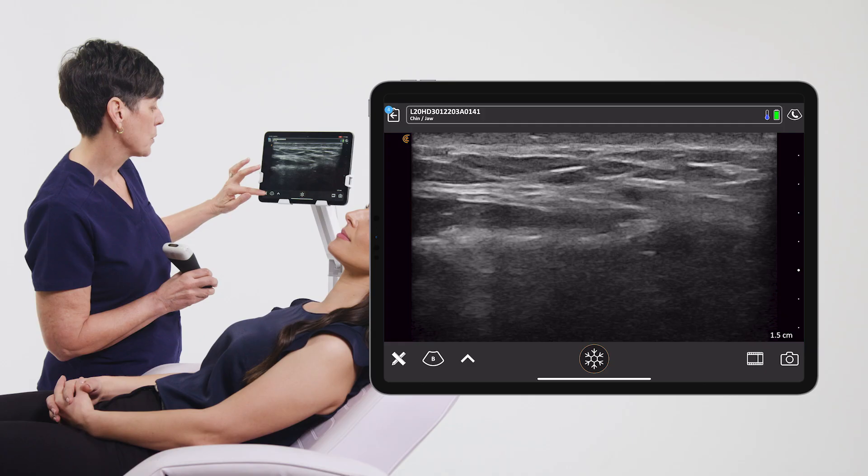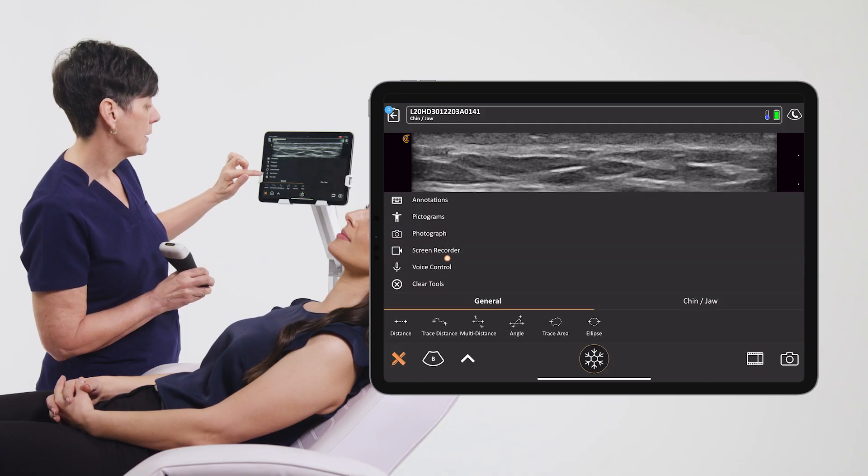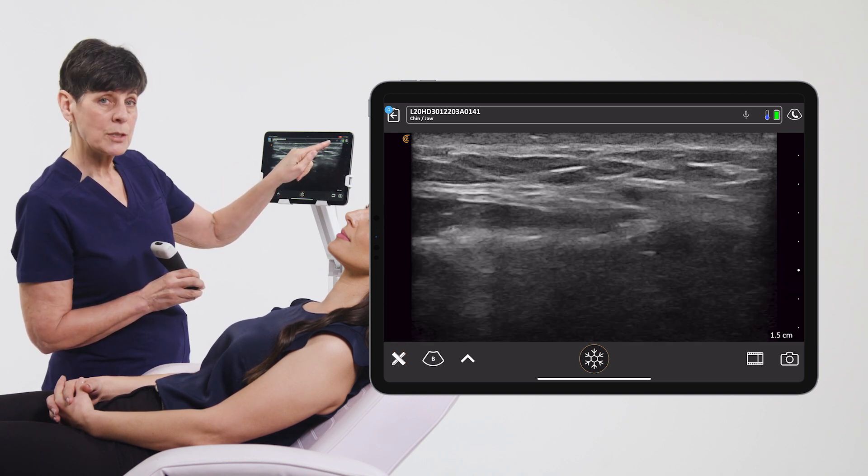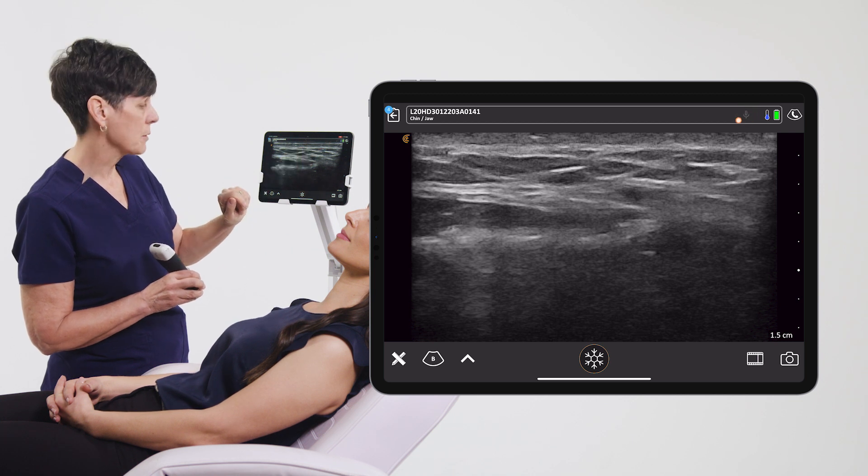So let's see how it works. We'll just go into the tools menu and tap on the voice control icon. Once it's activated, you're going to see a little microphone at the top right of the screen.